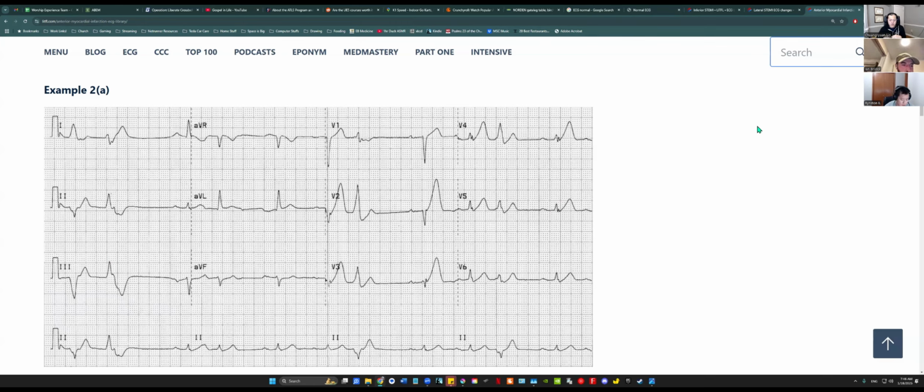So, elevation in two, three, anterior. What is that? Is there a drop in V2 and V3? You're missing something, or it's prolonged? It looks funky, but I don't have the super word. Weird. All right, I'm going to walk through this with you guys.